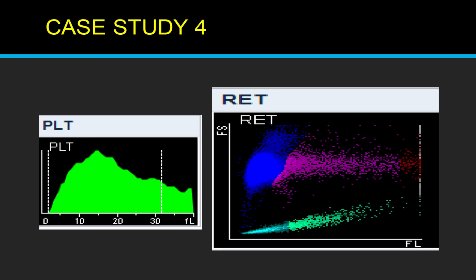You can again see that the typical platelet histogram is that of giant platelets, and the red scatter plot is again showing pretty high IPF. And that area to my right, which I am unfortunately not able to show, is the zone of the high fluorescence IPF. I will now show 3 of our studies that we had conducted over the last 4-5 years to establish the role of IPF and certain other markers as a prognostic marker in dengue patients.